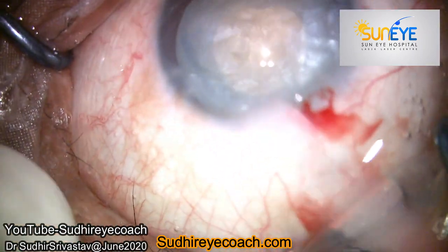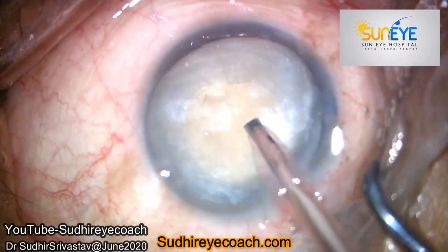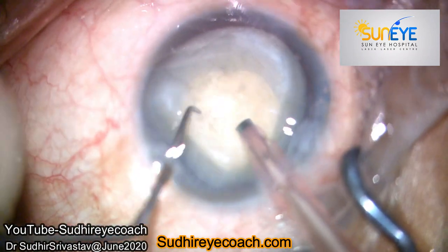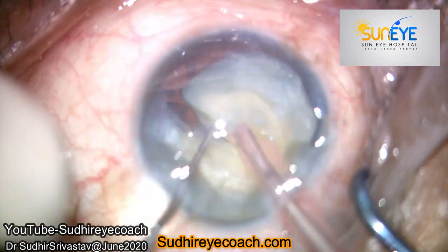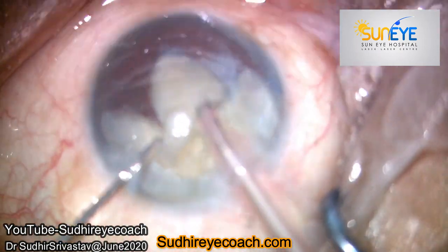Since I had cleared almost all the cortical matter, the nucleus became free and started behaving like a morgagnian cataract nucleus. You can see it is free-floating. Holding a free-floating nucleus becomes tricky sometimes.